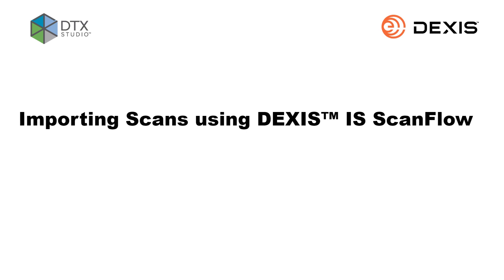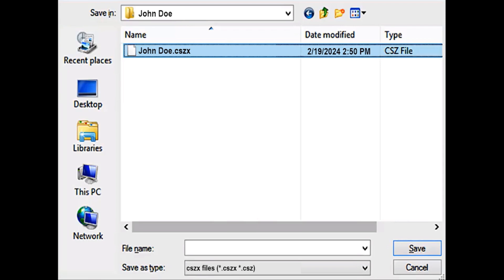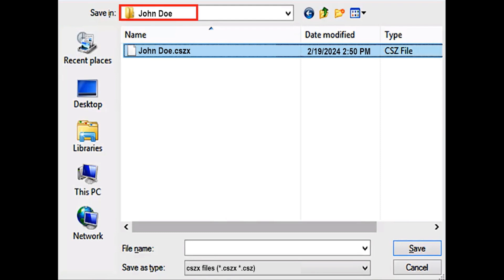Importing scans using DEXIS IS ScanFlow. Place the raw data cszx files in an accessible folder, for example, a desktop folder with the patient's name.